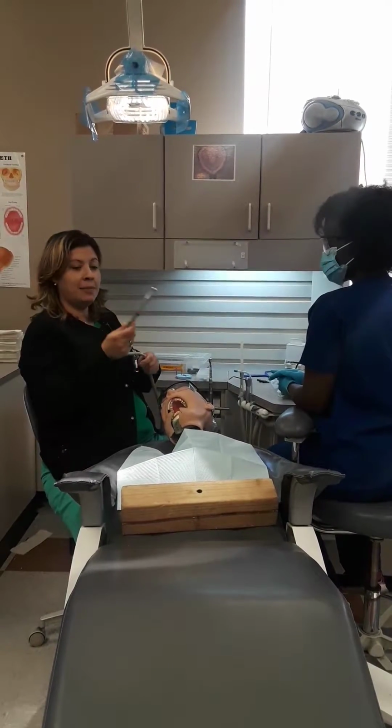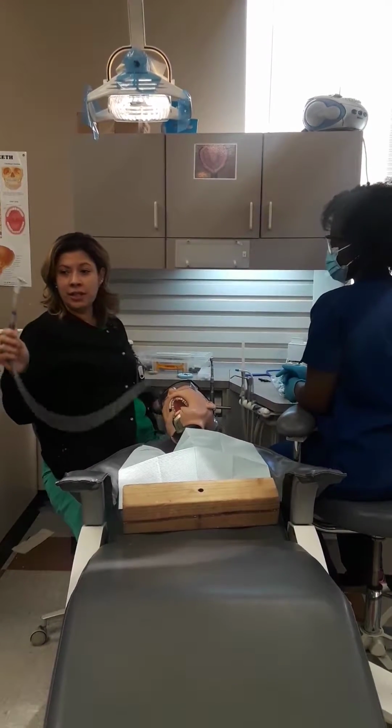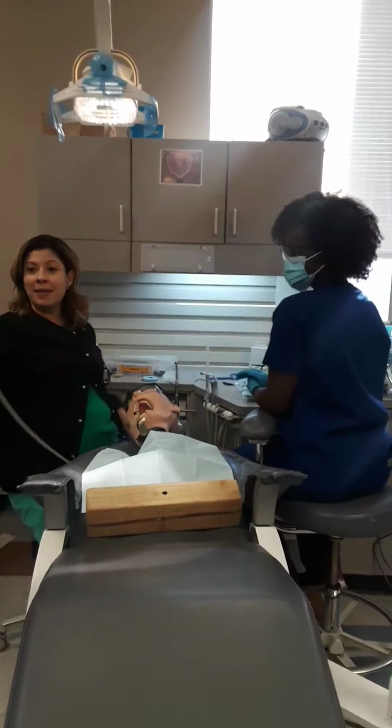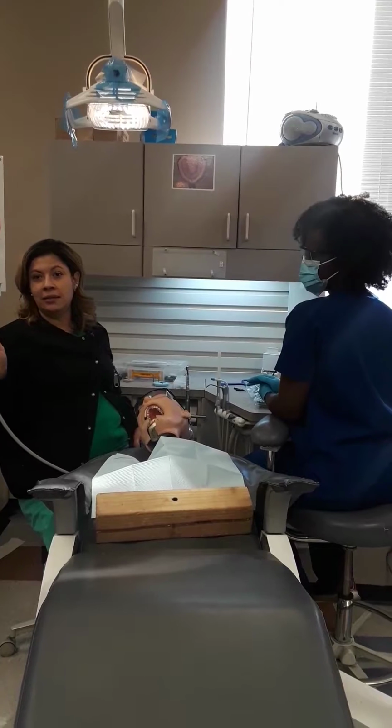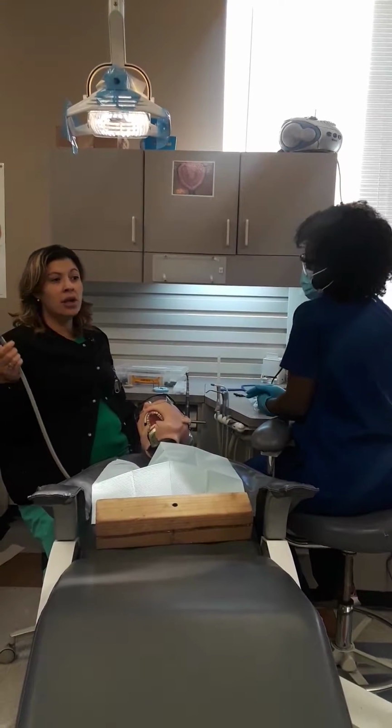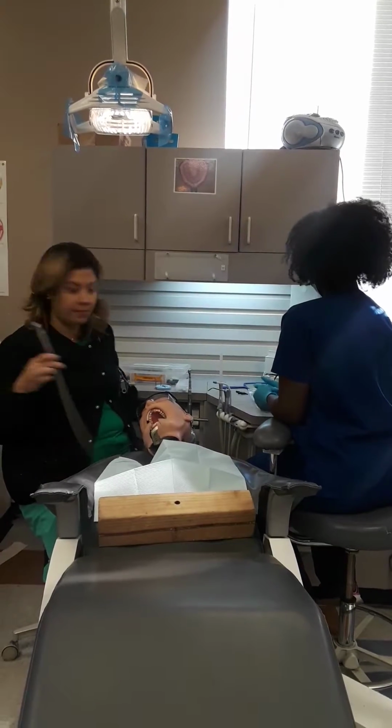Okay, here's my high-speed handpiece. Remember, new students, write it down. If you need, use the back of your paper. It's blank. The high-speed handpiece is a 1 unit. Okay, this is going to open the tooth or start the prep. So this is our prep instrument, 1 piece.